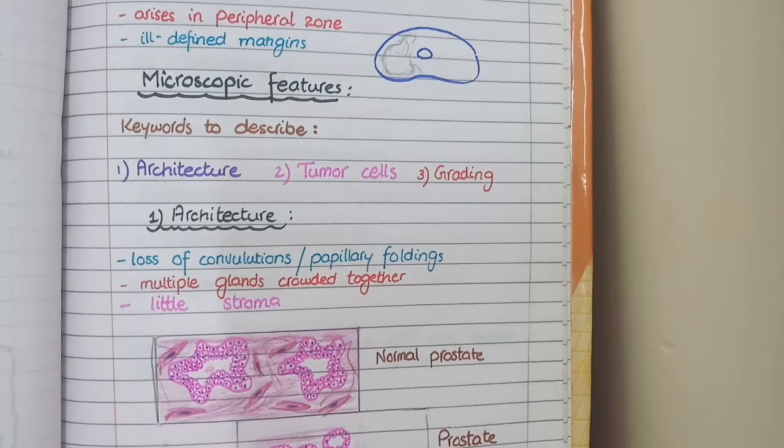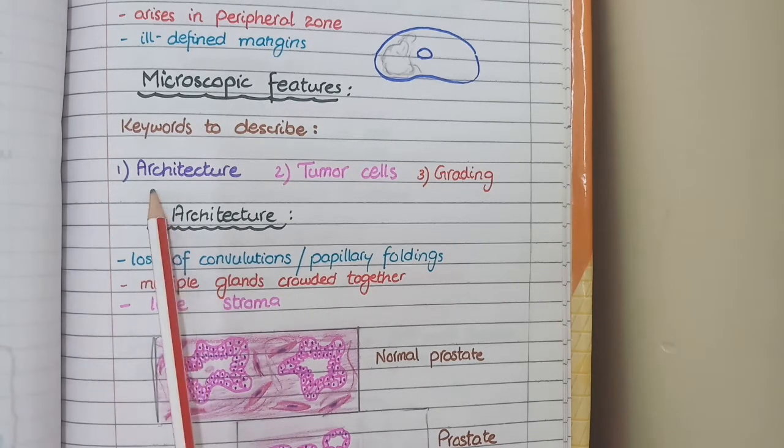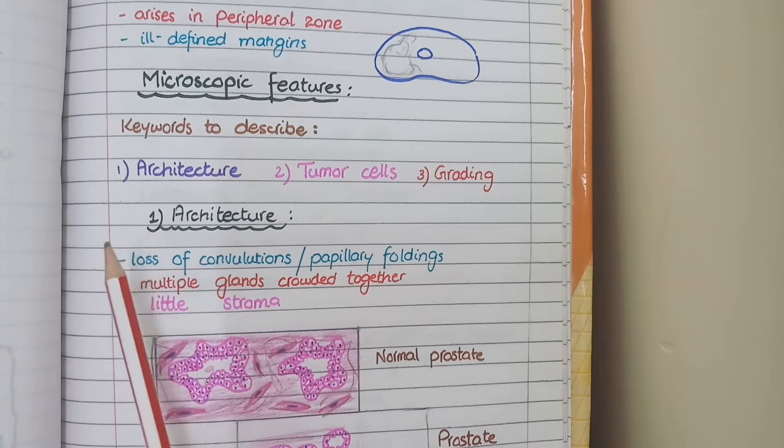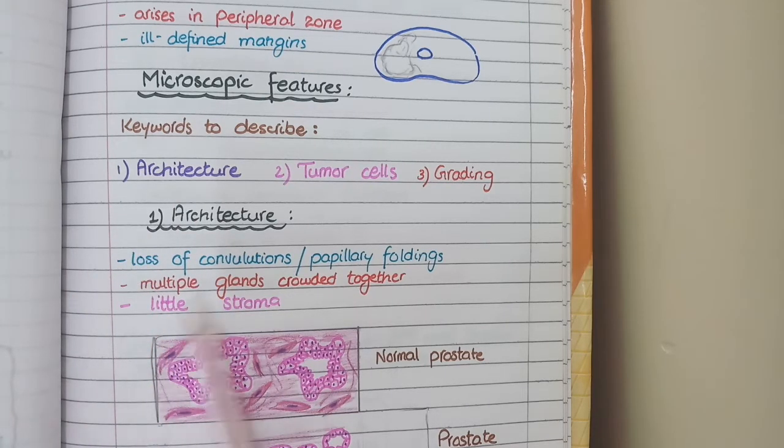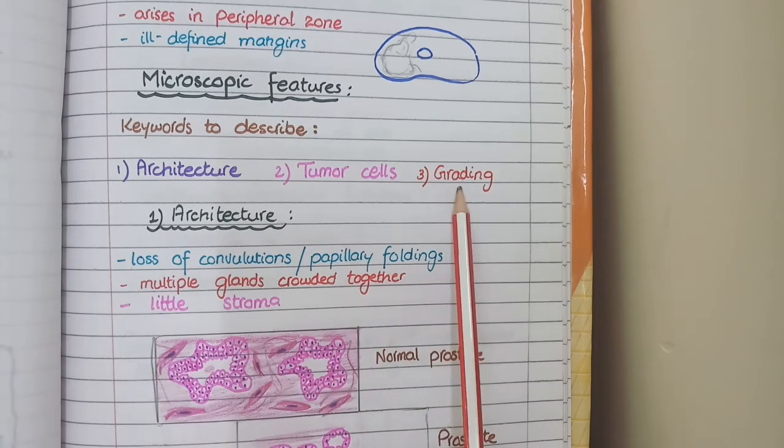Now let's come to the microscopic features of prostatic carcinoma. For microscopic features, you have to discuss the pathological changes under three main headings. First is the architecture in prostate carcinoma which means how does the overall neoplastic tissue appear on microscope. Second is the tumor cells, that how do the individual tumor cells look like. And third is the grading of prostate cancer, whether it is low-grade or high-grade.